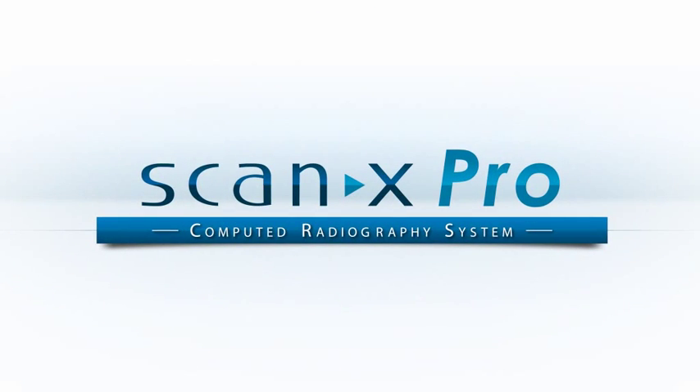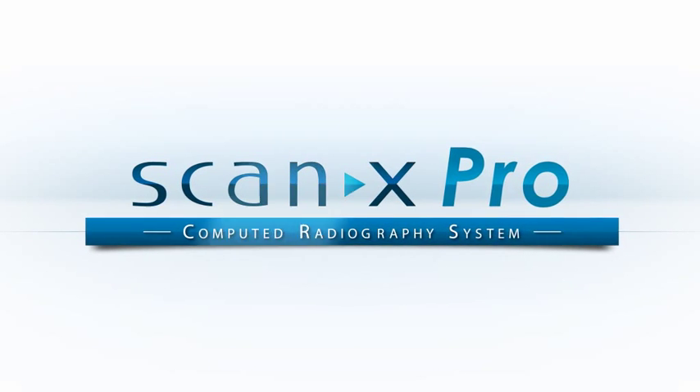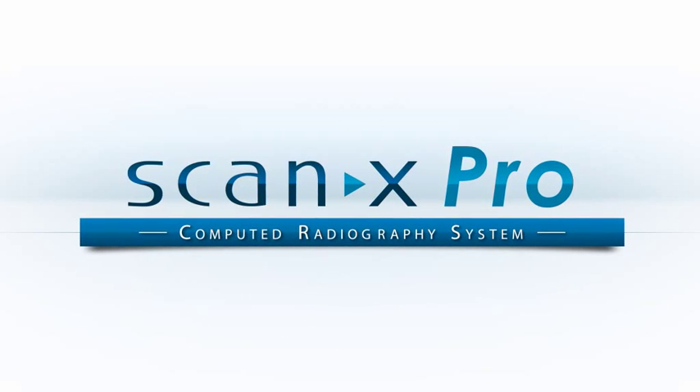Introducing the ScanX Pro, the first digital scanner that can scan imaging plates at two different laser spot sizes in the same machine.